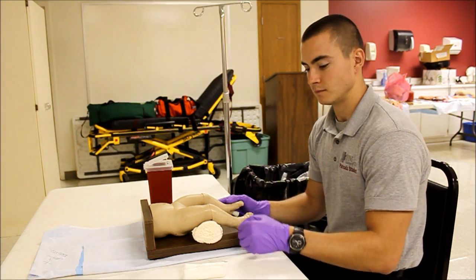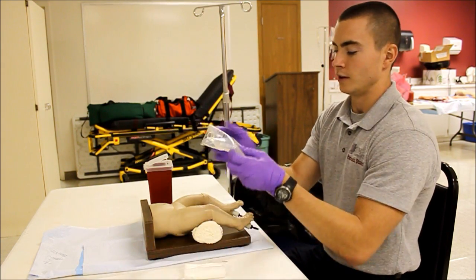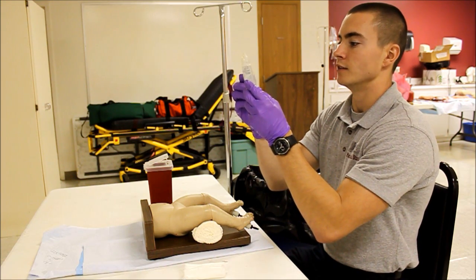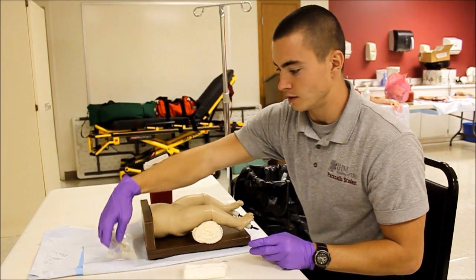BSI, scene safety confirmed. First thing I'm going to do is check my fluid, make sure that it is in fact the proper fluid, that it is not expired, and that it is clear with no particulates. I'm going to set that off to the side for now.